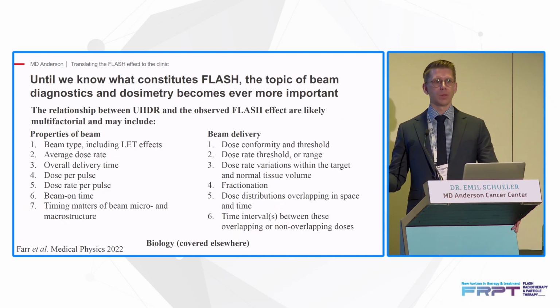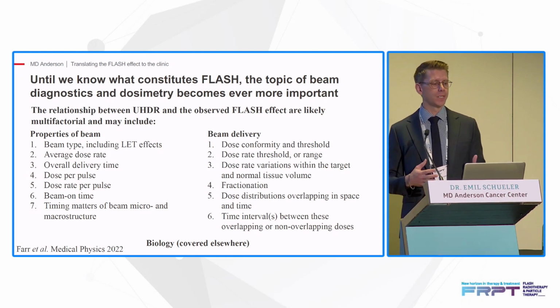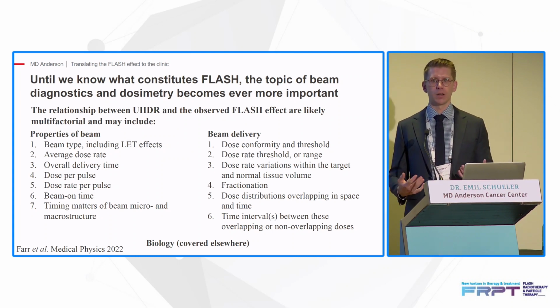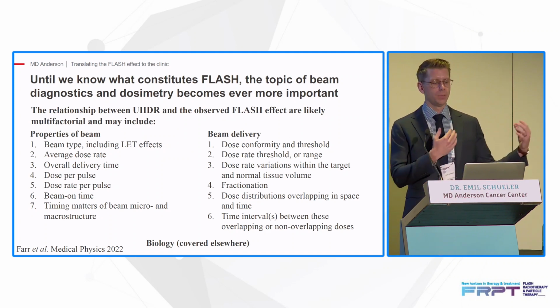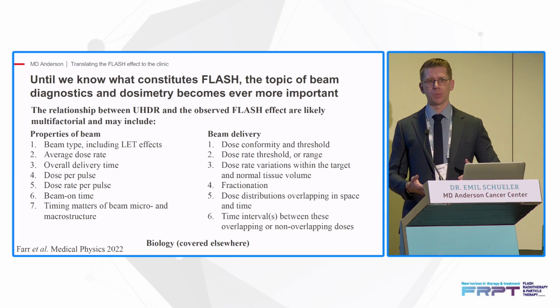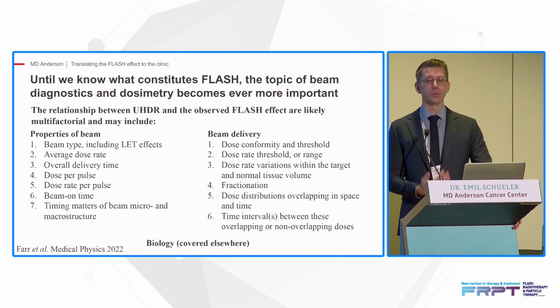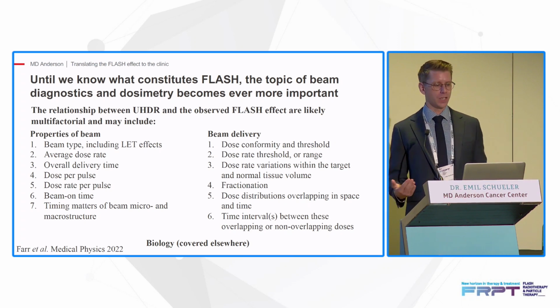So we're also pursuing clinical translation at MD Anderson, but looking at it from a program perspective and making sure that everything is safe and feasible. It really comes down to making sure that you know what you're doing when it comes to beam diagnostics and beam dosimetry, making sure you have the safety systems in place to be able to deliver the doses that you think you're delivering and want to deliver, but do that in a safe setting.